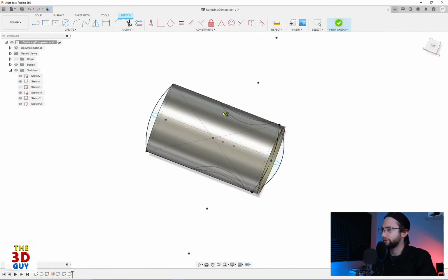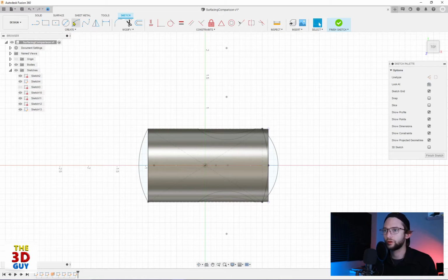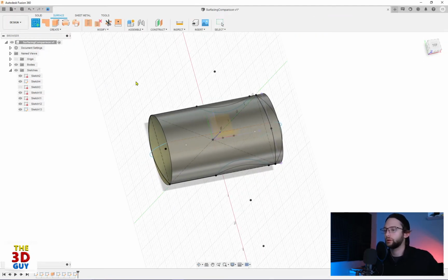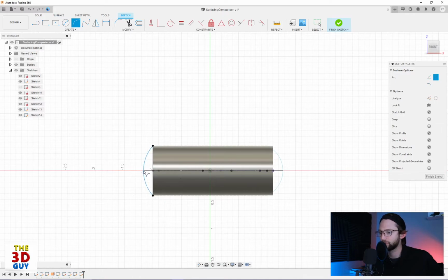Oh, bother. Wrong one. Okay. We're just going to create all these sketches while we're working. So these ones should be fine doing two at once since they'll be separate. If not, we'll have to go back and we'll just make some more again, which is not a problem.